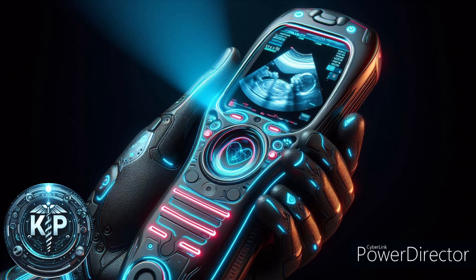The probe contains piezoelectric crystals that vibrate when an electric current is applied, producing sound waves. These crystals also convert the returning sound waves into electrical signals. Central Processing Unit, CPU. The CPU is the brain of the ultrasound machine. It processes the electrical signals received from the transducer probe and converts them into visual images. It also contains the electrical power supplies for the machine and the transducer probe.